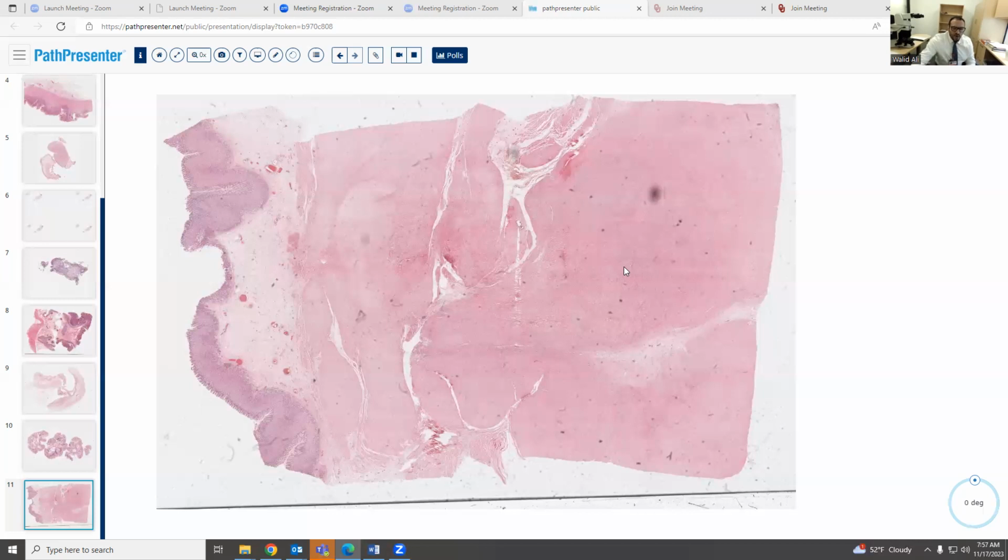It's better to do a trichrome to see the thickness. It should be a very well-defined, thick layer of collagen. That usually comes with practice. I think there's something called, I can't remember, a kindle-shaped collagen. Usually you see the collagen goes deep between the crypts and can even destroy the crypts.